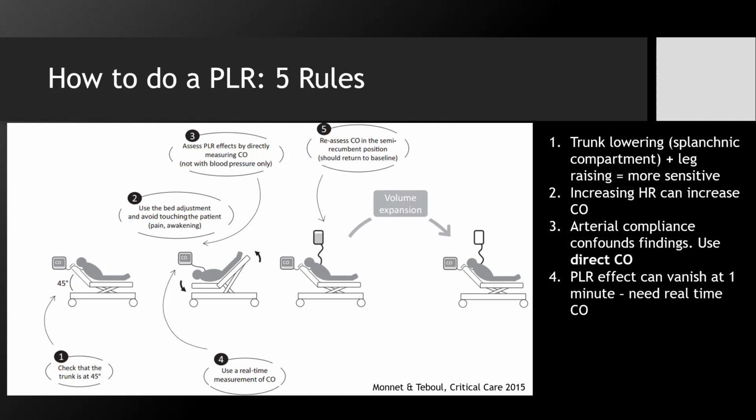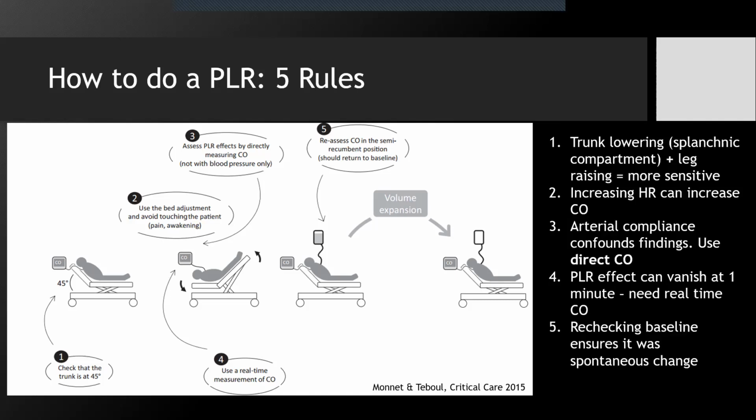That's why you'll need continuous cardiac output monitoring with pulse contour analysis, LVOT VTI, or bioreactance and impedance. And then you have to go back to baseline and see that the cardiac output returns to normal. That will be a check on the issues that I raised in number 2 here. It ensures that this change was due to your passive leg raise and not due to something else that may have happened at the same time, or maybe triggered by pain or agitation or something like that.